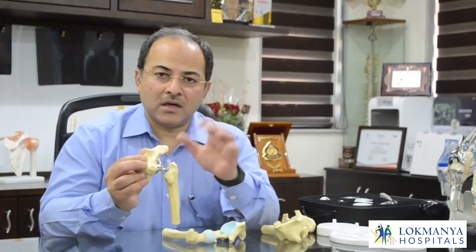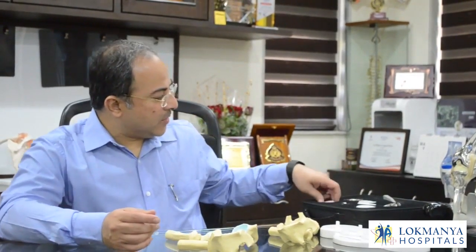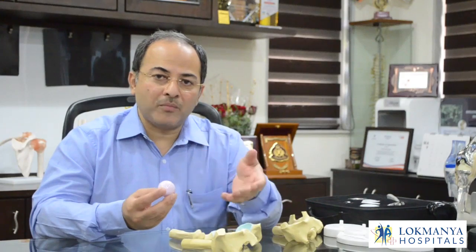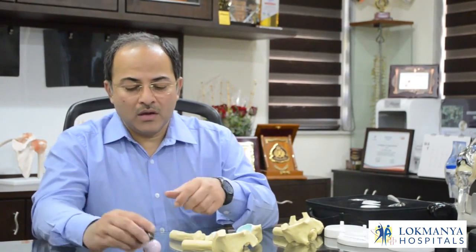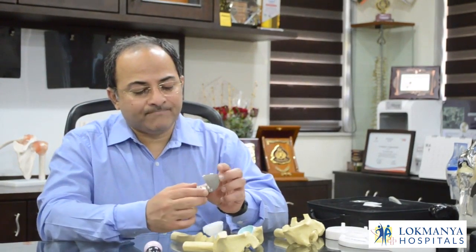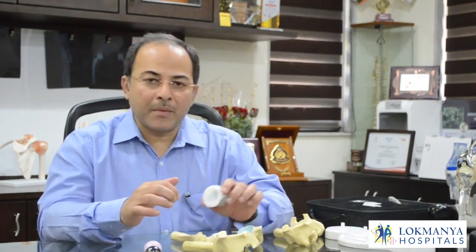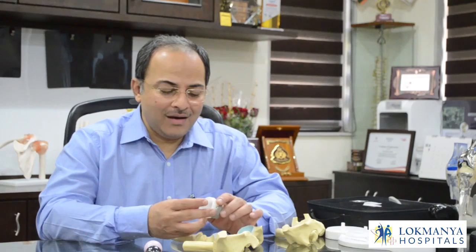The new hip joint doesn't cause friction, relieving the pain. There are various materials we can use. This is a ceramic material which is long lasting and doesn't give the problems seen with metals. There is also oxidized zirconium, which can sometimes be used and is more commonly used in younger patients. This is a shell for the acetabulum, and the liner fits inside it — various permutations and combinations can be used as per the patient's needs.